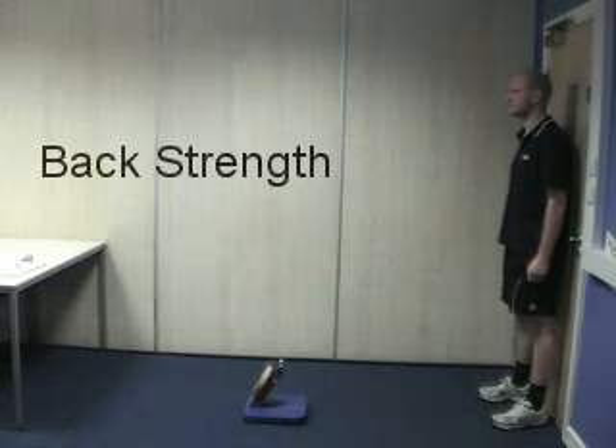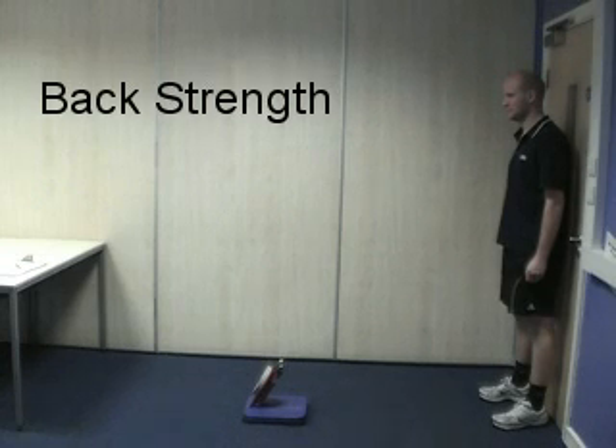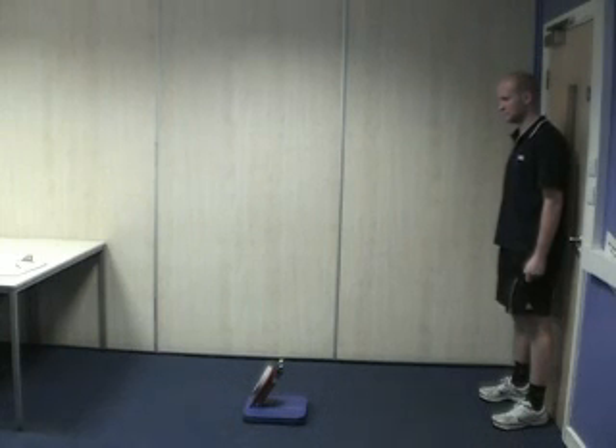Back strength testing procedures. For this test we will be using the back and leg dynamometer. Measures of static strength are used to establish baseline variables before training, to monitor progress during training, and to assess the overall effectiveness of a resistance training program.